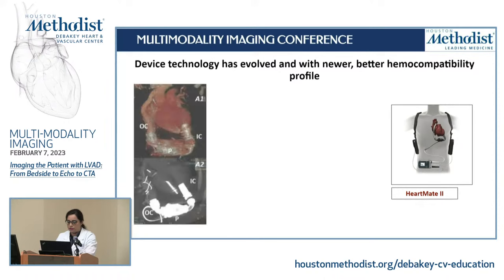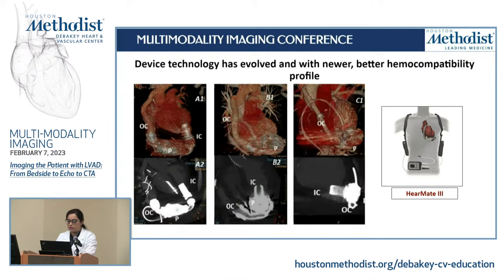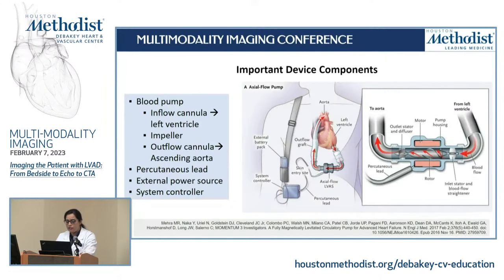So we went from HeartMate 2 to HeartWare to HeartMate 3, and right now, HeartMate 2 and HVAD are obsolete, and the only device we have is HeartMate 3. So most of my talk will be geared around HeartMate 3. What was disappointing in the most recent literature review for me is that not a lot was published in the last 2 years on imaging of HeartMate 3 devices and really trying to bridge those gaps in our understanding, and I'll talk about that a little bit later.